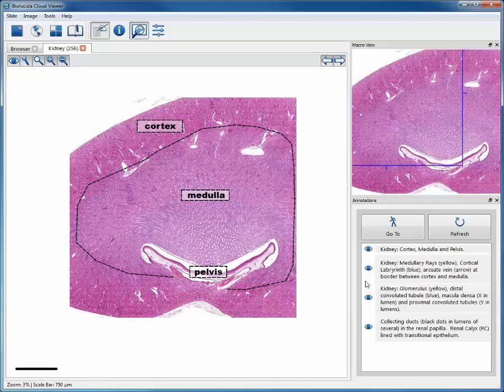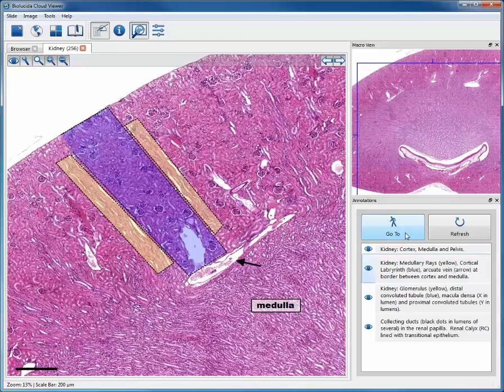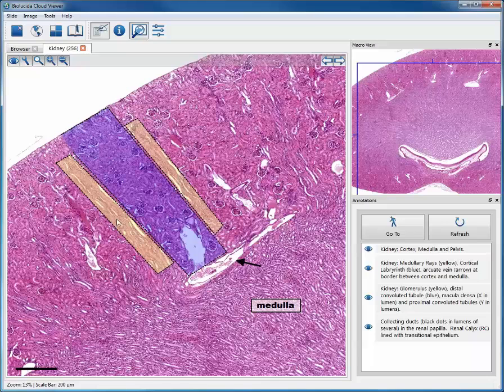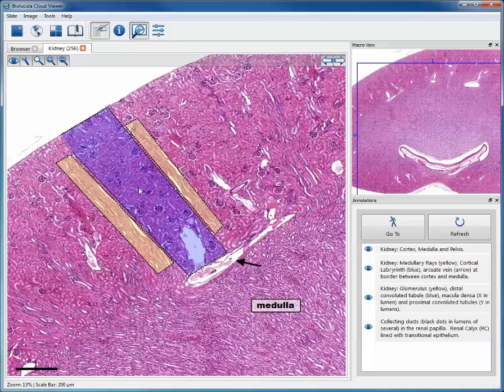Let's go to the next annotation where we can see some detail in the cortex. This is a medullary ray and this is a medullary ray. These are tubules that are straight and they connect to the medulla. And in between is the cortical labyrinth, and that is where you find the glomeruli and the proximal and distal convoluted tubules.